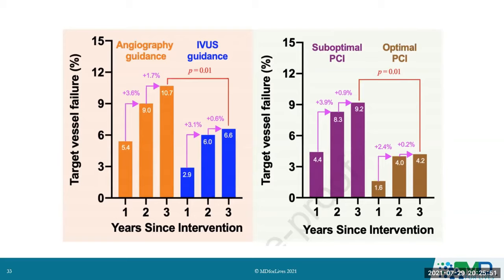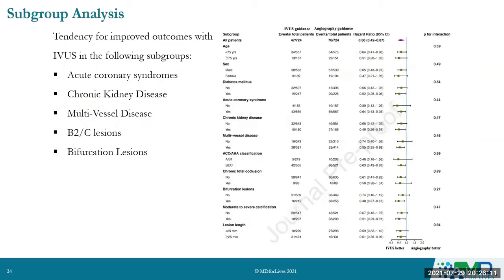And this is also an argument that early on in my career somebody raised, asking, well, you're in there with an extra vessel, you're in there longer, isn't that more dangerous? I think that no, we don't have any evidence that putting intravascular imaging catheters, whether it's OCT or IVUS, in the vessel increases the risk of the procedure for anyone. And hopefully this data and the rest of the data that we'll discuss shows that it's actually beneficial.